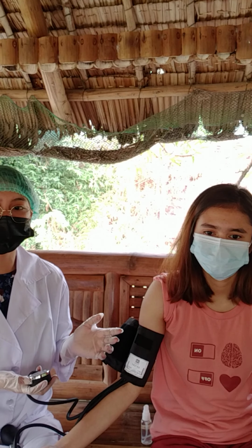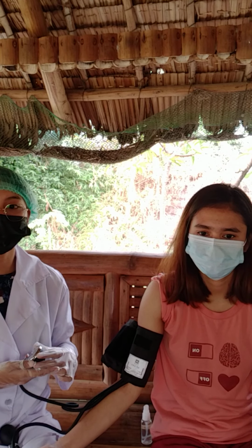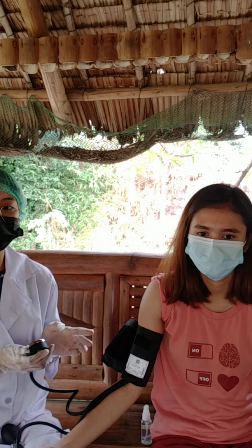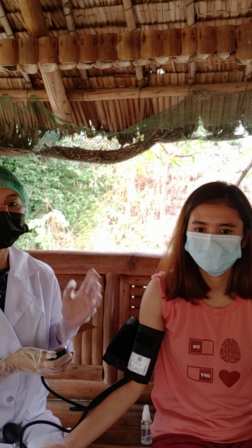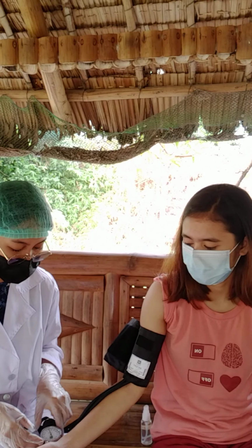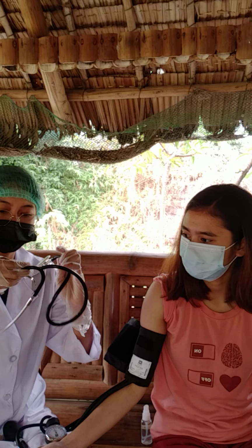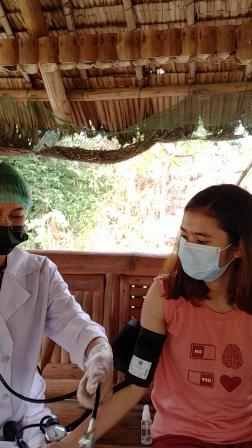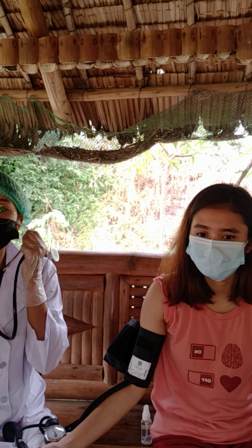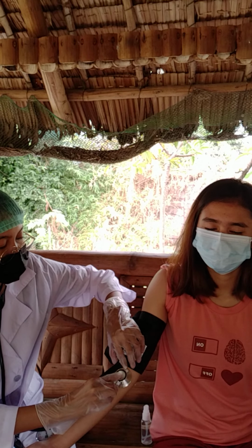So, assume a position that is no more than 3 feet away from the gauge. And then after that, place the stethoscope earpieces in your ears, direct the earpieces forward into the canal and not against the ear itself. So, I have here my stethoscope. And place dito sa may pulso niya.